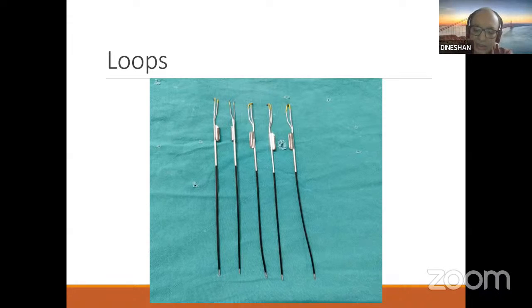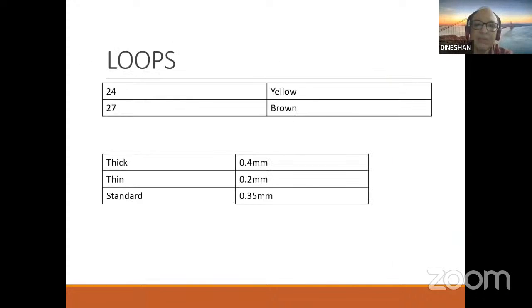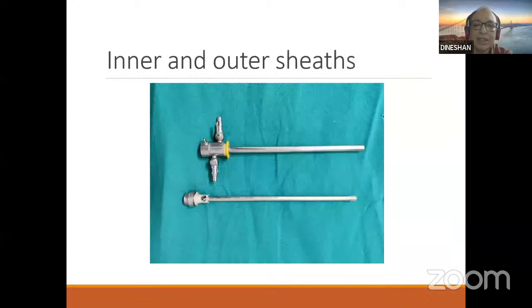Once the cutting is completed, it should come just inside this sheath. So then only the tissue will get detached. So if you have an obtuse angle, even if you complete the resection, the tissue will not get detached.